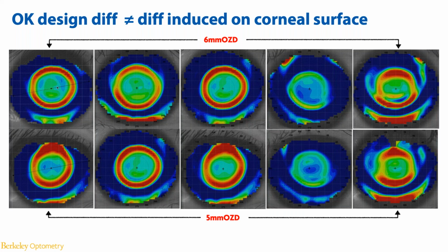Again, as I said, my top indications: number 1 is for existing CRT patients, if I see a subtle pseudocentral island, my go-to problem solving would be a smaller OZ. And the second is if I'm seeing an anisometropic patient, I will probably use 2 different OZs for 2 eyes. And third, if I'm fitting a smaller cornea, I will definitely use a 5mm OZ.